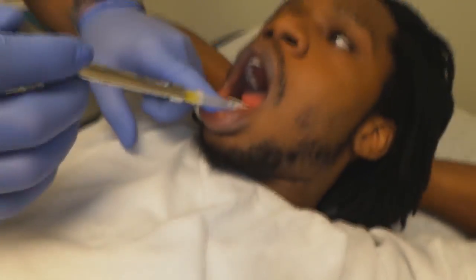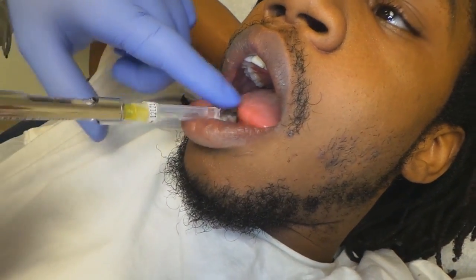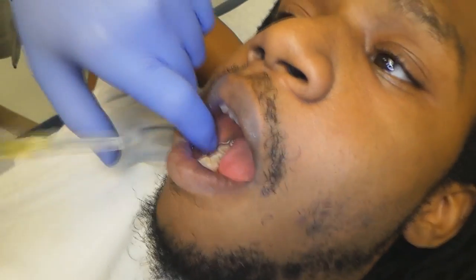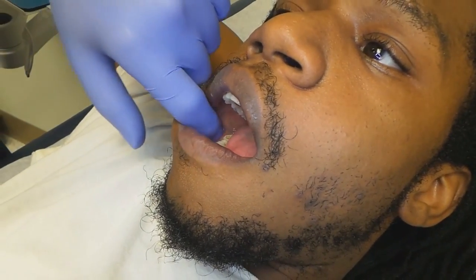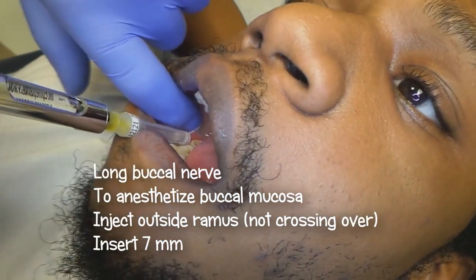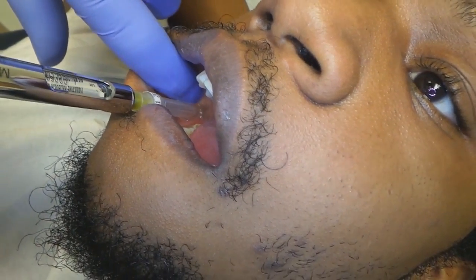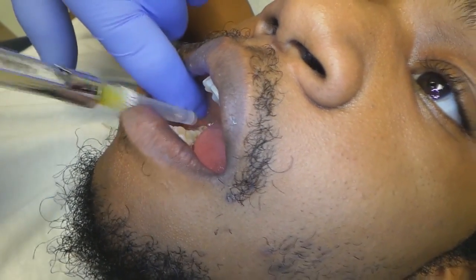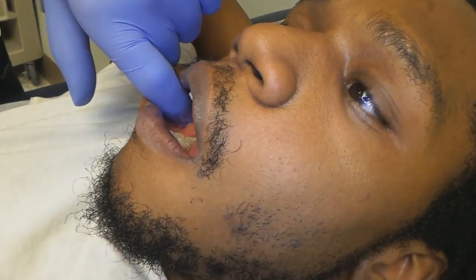The inferior alveolar block covers all the teeth all the way down to the central incisor on the same side. However, the whole buccal mucosa still feels sensation. So you want to give the long buccal injection — come right to the outside of the ramus and advance about seven millimeters. Deposit the anesthetic on the lateral of the bone. That's the long buccal.